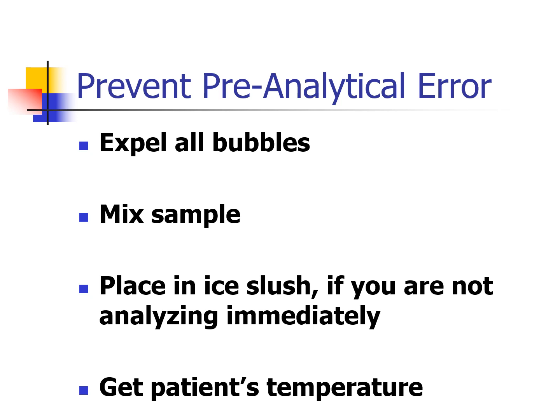We're going to mix the sample. This just does not mean shaking at all, right? This is not a shake weight. This is not something that you just shake around. You're going to roll it in your hands. Literally just roll it back and forth in your hands and just sort of mix that heparin and the sample together.